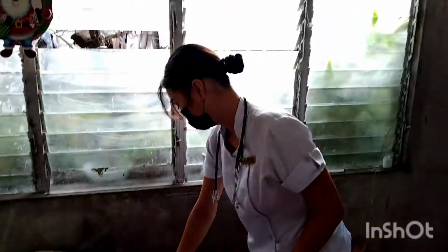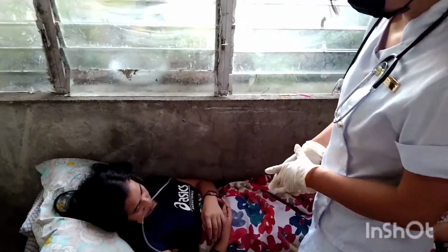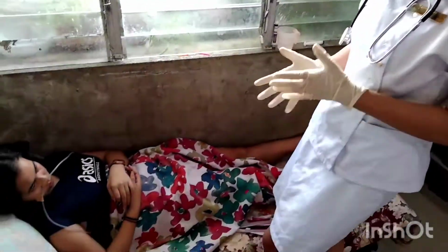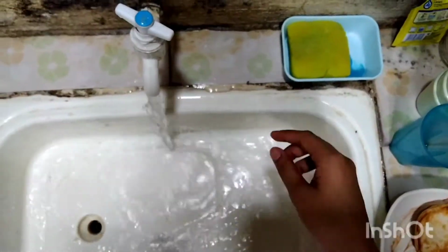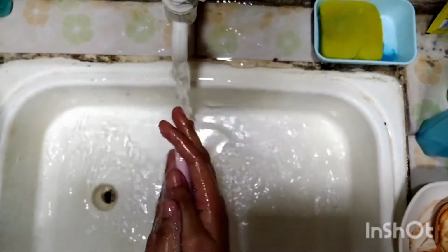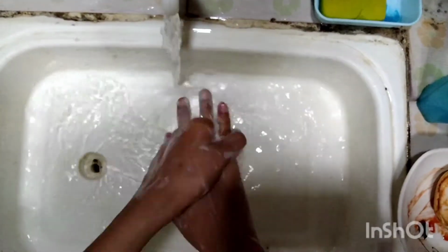For the procedures, step 1 is to explain the procedure to the patient because discussion and explanation help allay anxiety, encourage patient cooperation, and prepare the patient for what to expect. After explaining the procedure to the patient, perform hand hygiene because hand hygiene deters the spread of microorganisms.